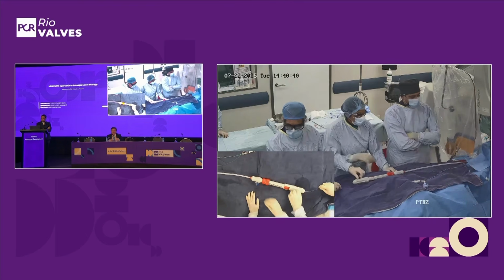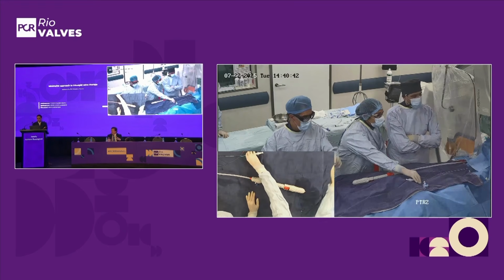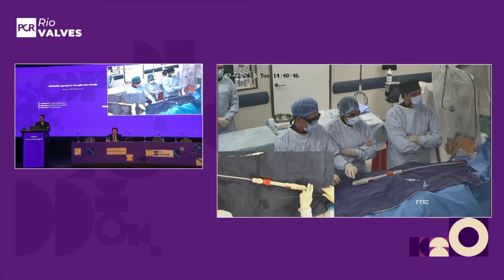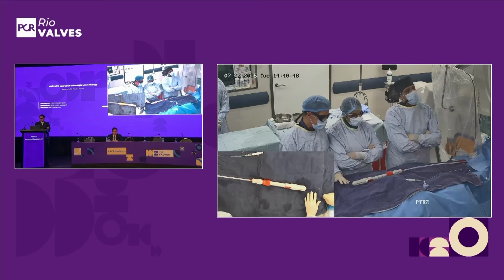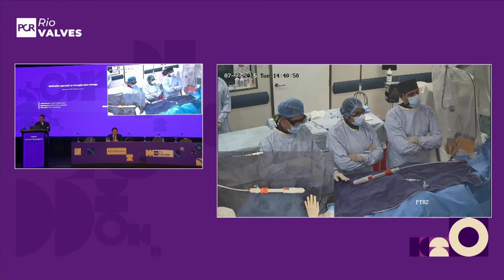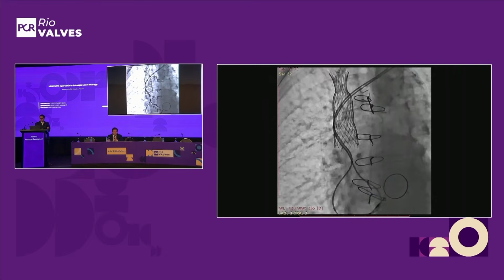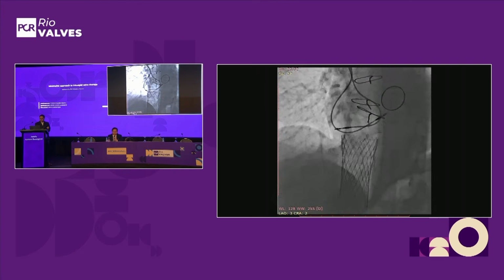We are very, very happy with the pressure, with the angio, with the position, and with the echo also. We have no more leakage in the right part. Perfect.